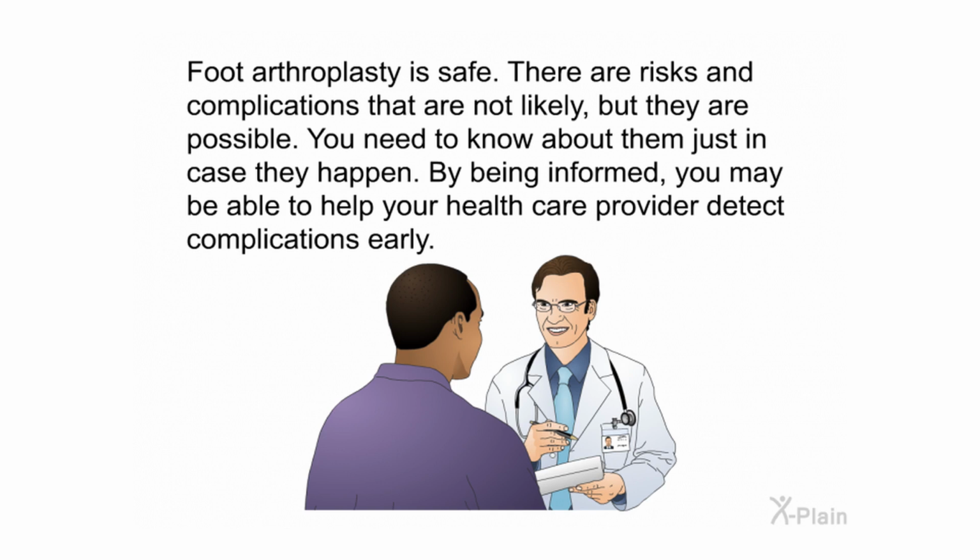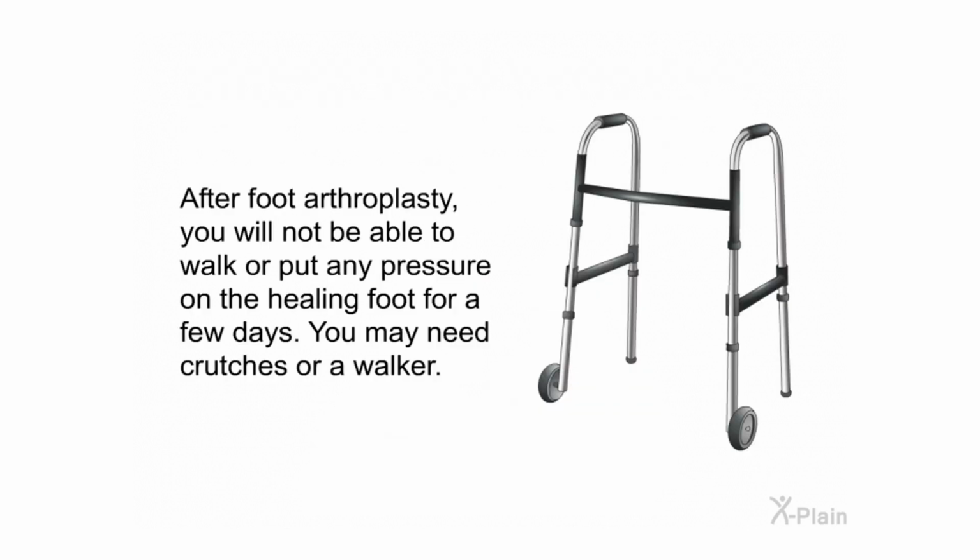Foot arthroplasty is safe. There are risks and complications that are not likely, but they are possible. You need to know about them just in case they happen. By being informed, you may be able to help your healthcare provider detect complications early. After foot arthroplasty, you will not be able to walk or put any pressure on the healing foot for a few days. You may need crutches or a walker.